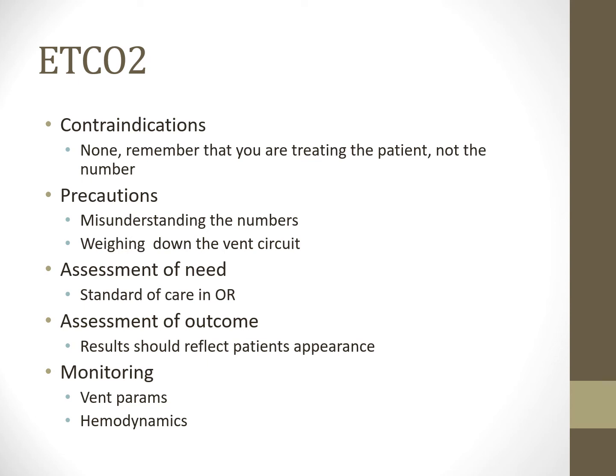Precaution, people might misunderstand the numbers or the waveforms. They don't do their homework. They don't read. They don't understand. They don't master these patterns and waveforms. And that could be a big detriment because if they make a wrong interpretation, it could send you down a whole bad pathway. So I'm a big stressor on going over this information. Other things too, it can weigh down the vent circuit, especially on neonates that don't have a cuffed endotracheal tube. That could be an issue. It can weigh down the circuit a little bit there too. It depends if it's a side stream or a mainstream.